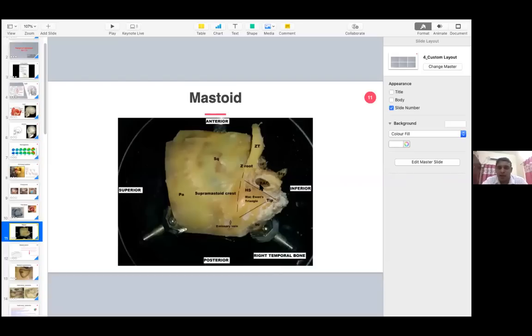You are going to enter the facial recess once again, even in the case of the Varia technique. Where to start, where to end? Superiorly or laterally, the start of the drilling is at the 11 o'clock position, and you enter the middle ear through the facial recess at the 10 o'clock position. You are always going to guard the drill system by keeping the guard in the external auditory canal.